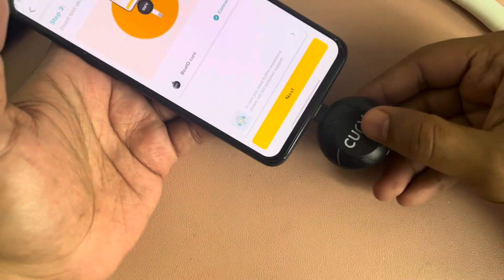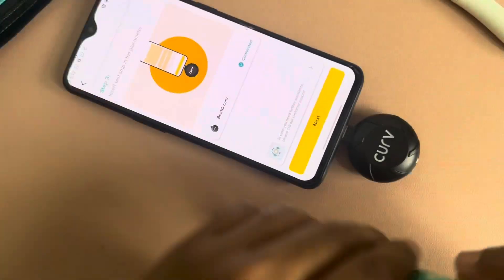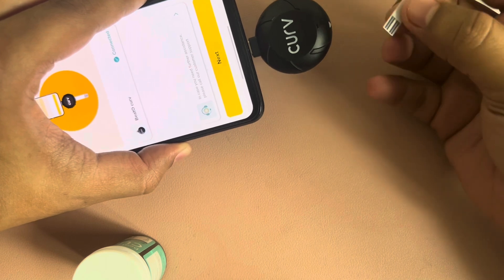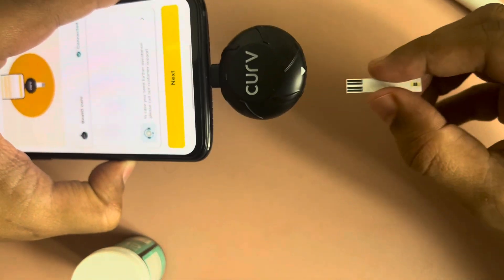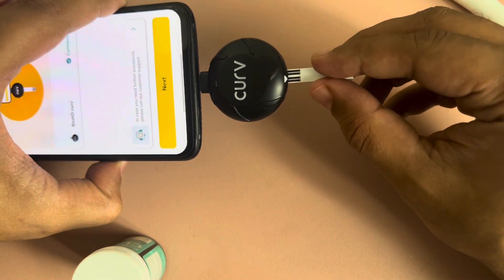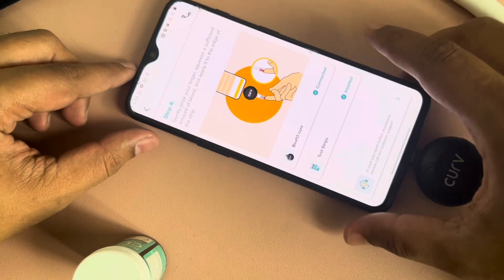Once the device is inserted you should see a message to insert the strip in the glucometer. So let's insert the strip. This part has to go in with the arrow mark — there's a little slot for it. Just need to insert this.